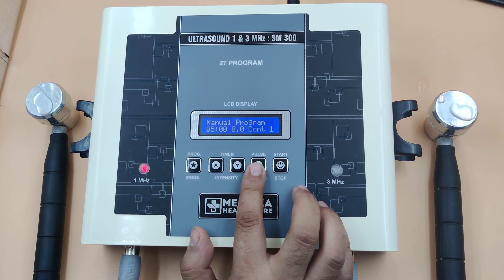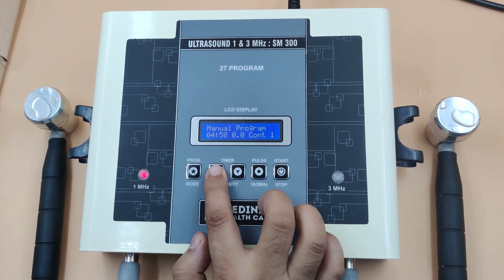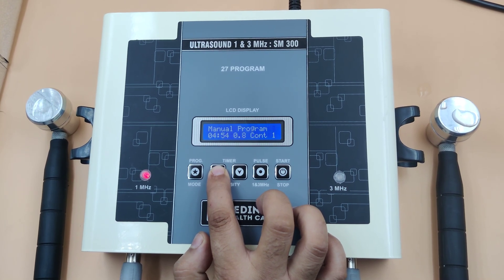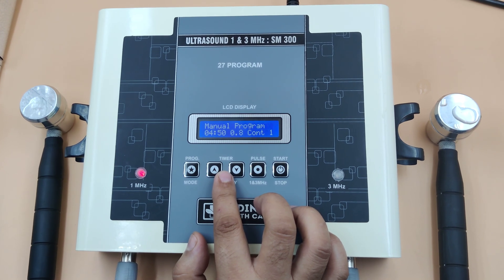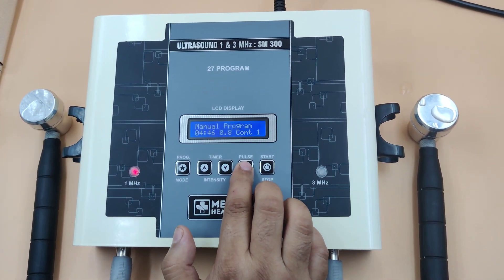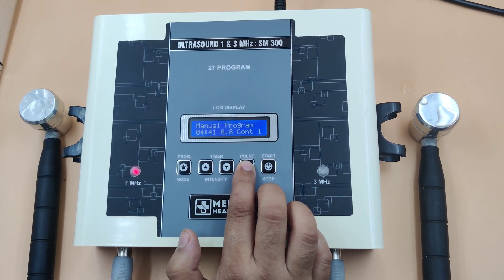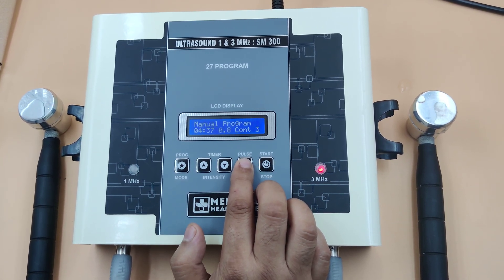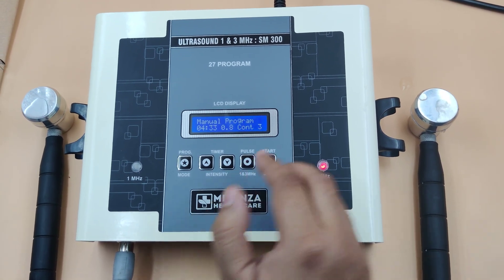Start the manual program and increase the intensity as per your need. You can shift the current from 1 megahertz to 3 megahertz by pressing this button — 1 megahertz, 3 megahertz, back to 1 megahertz, again to 3 megahertz. After the treatment is completed, switch off the machine.